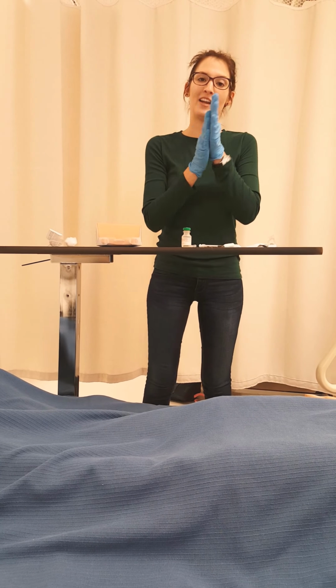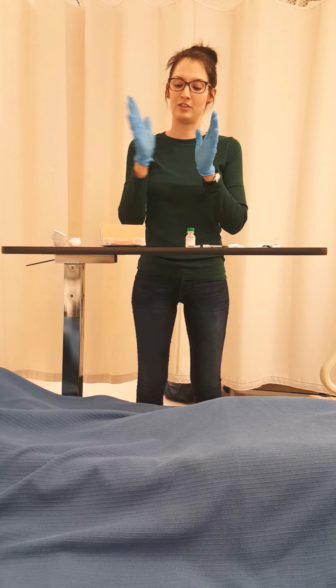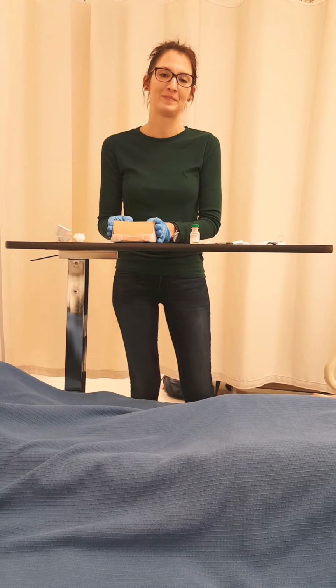I will then provide hand hygiene again. Ask the patient if there's anything else that they need, and come back to double check to make sure that there's the right therapeutic effect for our injection.